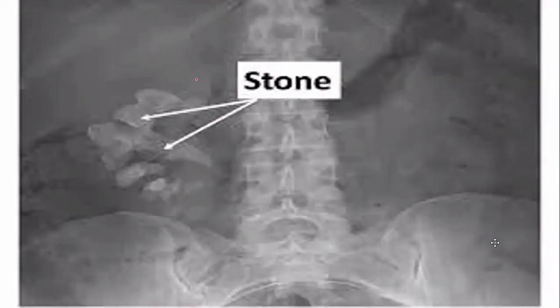So, what do you think is it? Is it a staghorn? Yes, that's a staghorn. It assumes the shape I told you about. It assumes the shape of the pelvocalicial system. Look at this, the pelvocalicial system. So it is presuming that is the medulla here. A staghorn assumes the shape of a pelvocalicial system. Oh, that's why it looks like that.